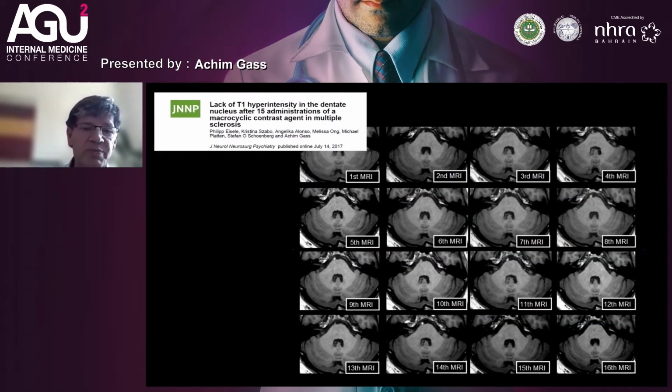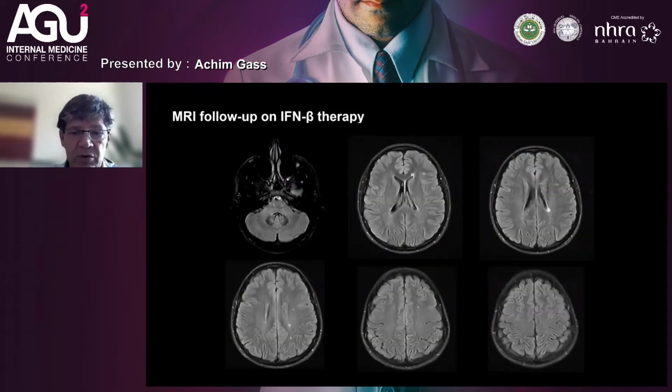Now we only use macrocyclic contrast agents. Before, linear gadolinium compounds were also allowed, and with those you could see depositions of gadolinium in the dentate nucleus of the cerebellum. But as you see here, with macrocyclic agents, this is no longer the case, and so I think we are in a very safe place with our contrast enhanced imaging.